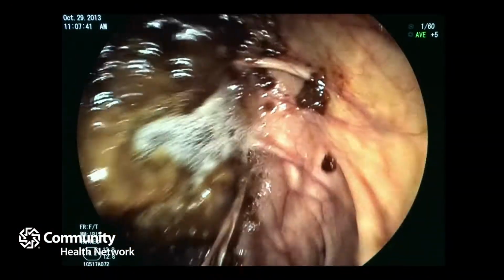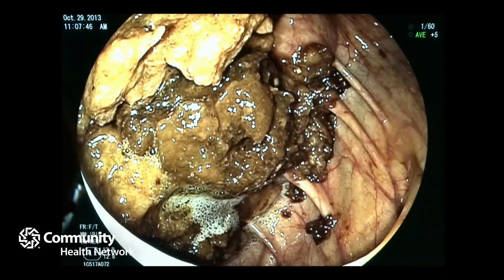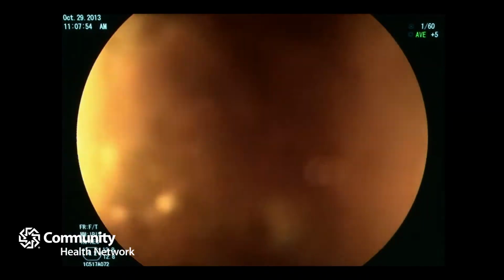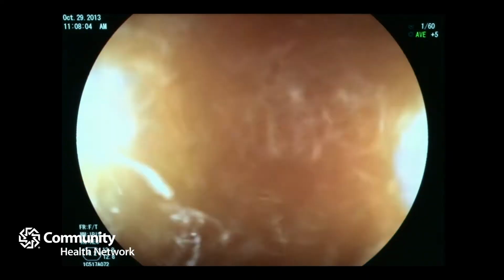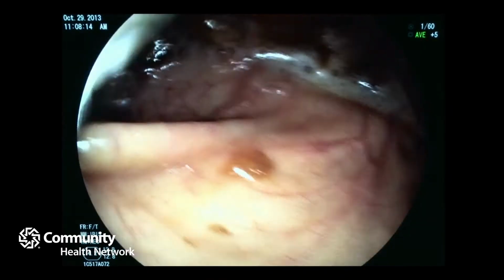Here's a negative, not to stop that question, but here's where we have a limitation. That part of the prep is not ideal, so this part is going to be difficult. We're going to sandblast this as best we can and try to get through. This will be one of the reasons your physician may say, I need to bring you back because the prep was not ideal. So I'm trying to get rid of as much of this as I can, and I'll blast it away and look. But this is a limitation of colonoscopy. Sometimes we have to bring people back. And this wouldn't matter what technique you wanted your colon checked with, whether it's CAT scans or blood work. To look is still the ultimate idea.